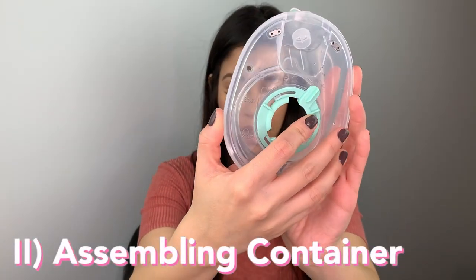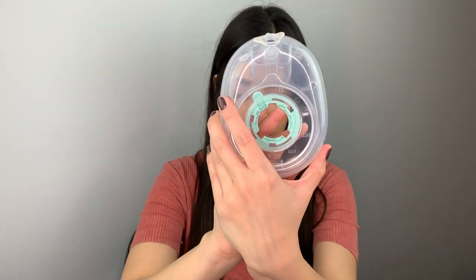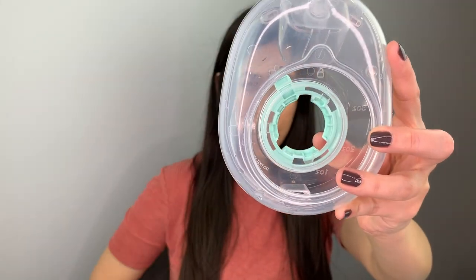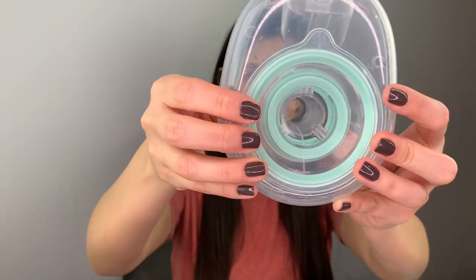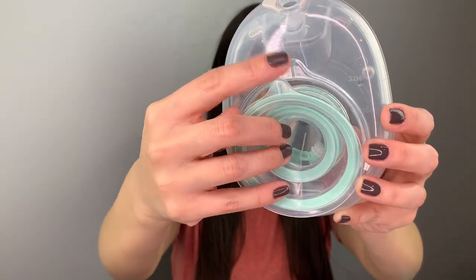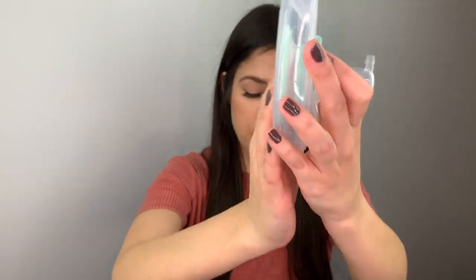So let's move on to how to assemble the container. This will be the back part of the container and this will be the front. You're going to take the insert and just insert it into the middle of the container. Make sure that the tabs are aligned — these are the tabs right here. When you press on it, make sure it's a flat surface with no bumps, so you know it's properly attached.